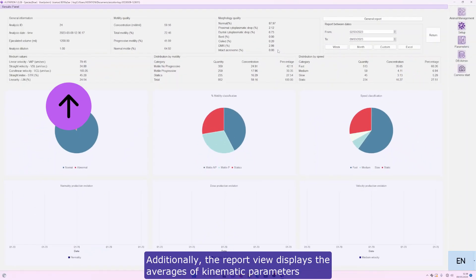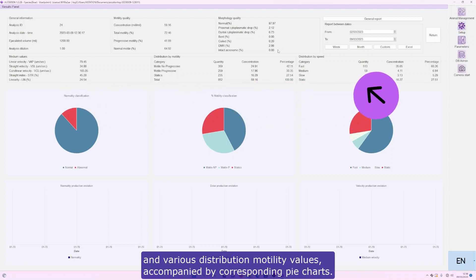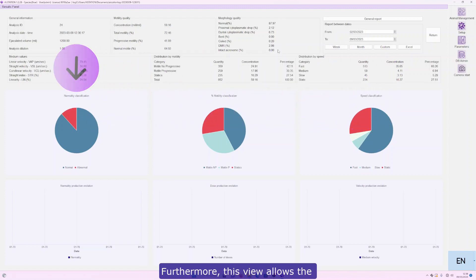Additionally, the report view displays the averages of kinematic parameters and various distribution motility values, accompanied by corresponding pie charts.